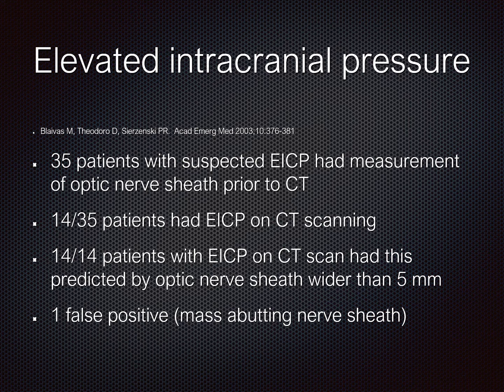So the principle behind ultrasound measurements in elevated intracranial pressure is that if you imagine the increased intracranial pressure really only has two places that it can go. It can go down your spinal cord or out through your retinal optic nerves out to your retinas. And so increased intracranial pressure would cause edema and swelling of the optic nerves as the pressure sort of popped out through your eyeballs, and that edema could be measured as an increased diameter of the optic nerve.